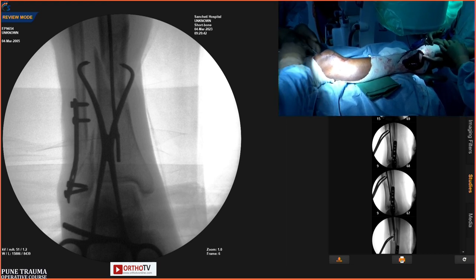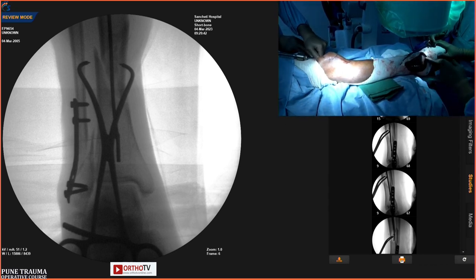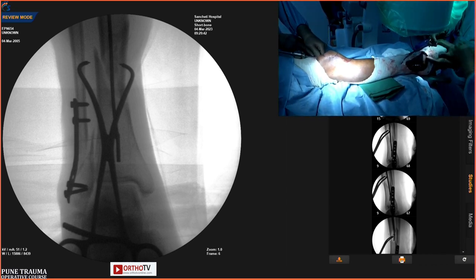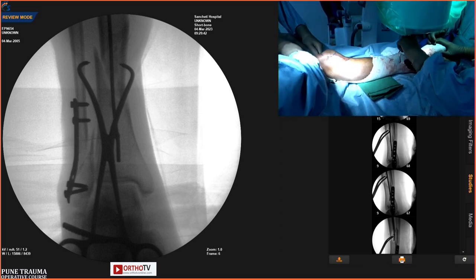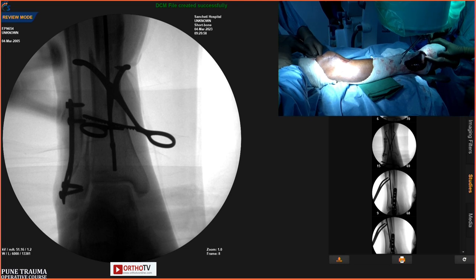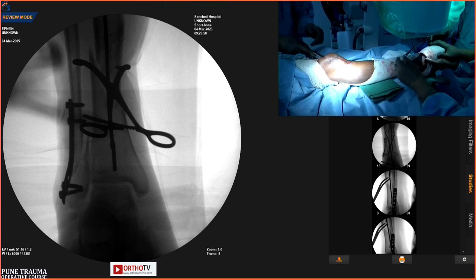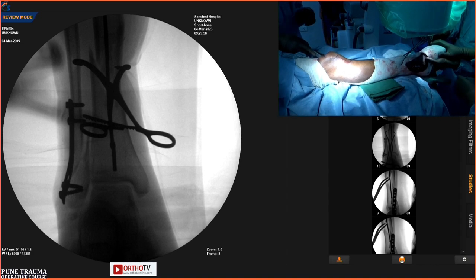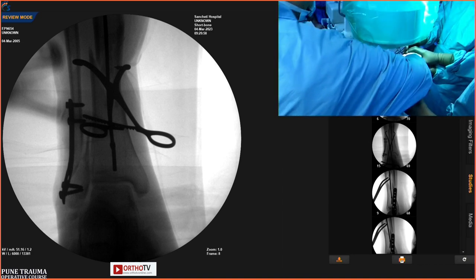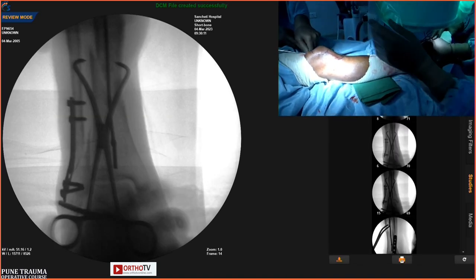Is this the center in AP? If you see, just move that clamp. See? Okay. A little more laterally would be a preferred trajectory? We'll do it, sir. Okay, it has gone.